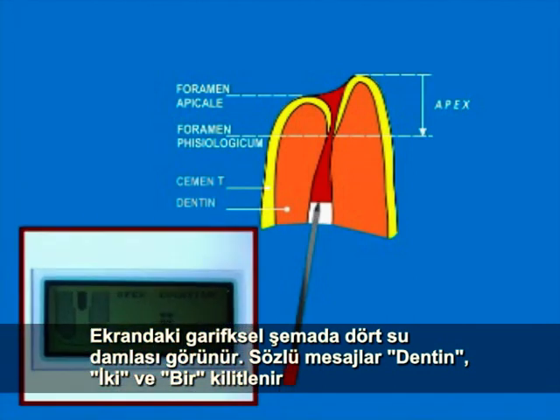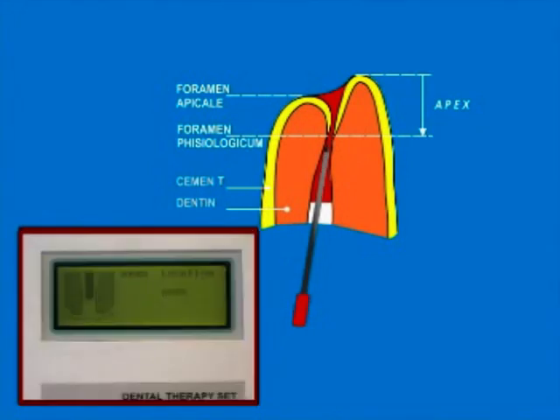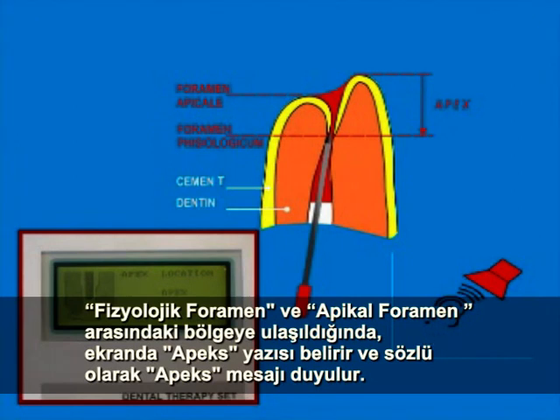The speech messages dentin, 2, 1 are locked, and there is only an interrupted alternating frequency sound signal. On reaching the area between foramen physiologicum and foramen apicale, the device writes Apex on the display and announces a speech message, Apex.